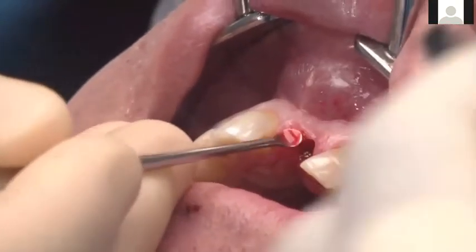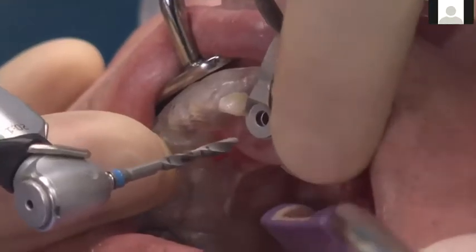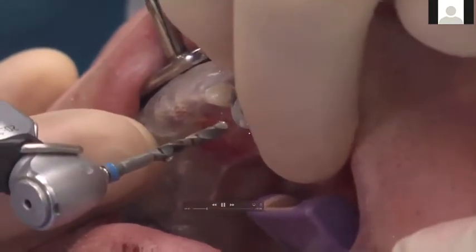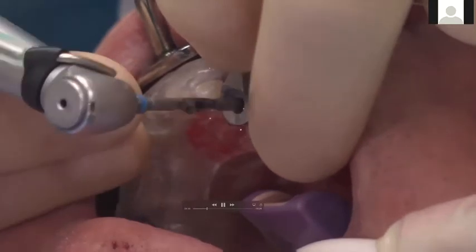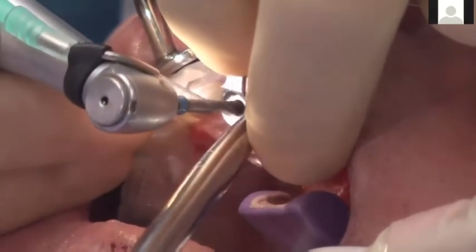All right, so once you do that, then you can go ahead and basically put your guide back on. And here's the guide back on. You can see it's been stabilized here with a bite block. And then this is the initial key for the Straumann 2.2 drill.